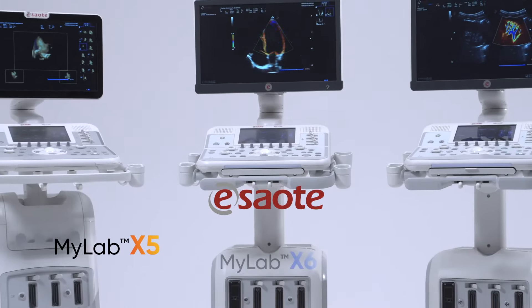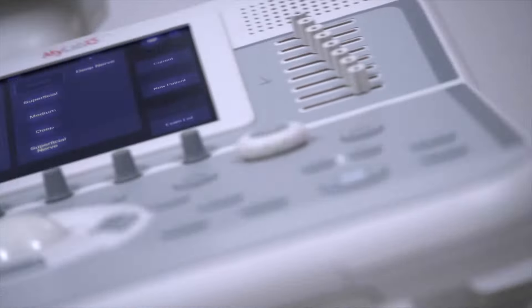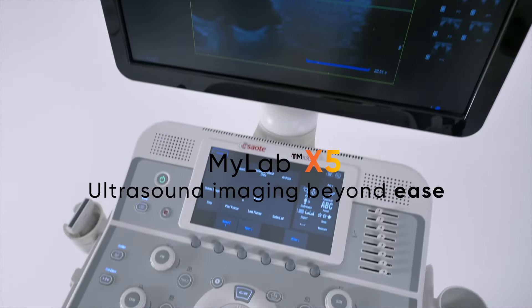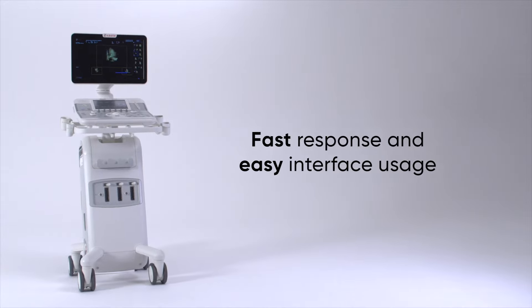Introducing ESAOTE MyLab X5, X6, X7. ESAOTE MyLab X5 — Ultrasound Imaging Beyond Ease. Fast response and easy interface usage.